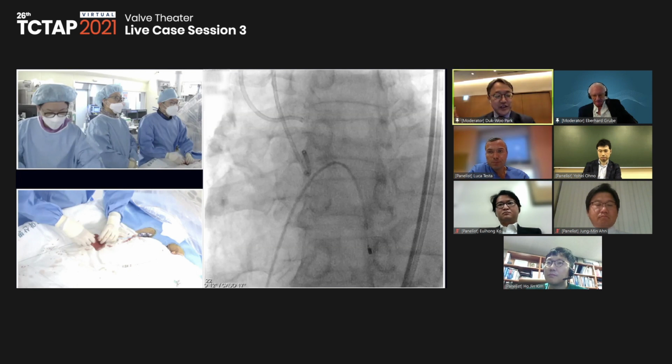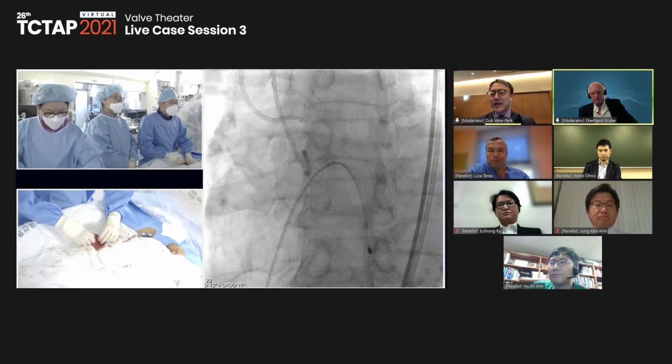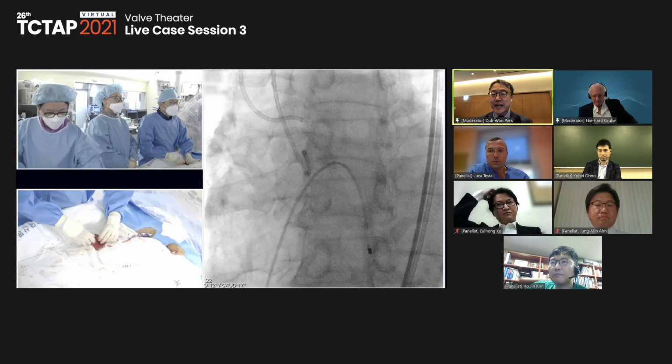And the second question to Eberhard and the other panel: sometimes a patient has creatinine more than 2.0 or 2.5 and is not eligible for CTA in the CT. What is your recommendation? Nowadays we have some painful experience with 3D echocardiography measurement, and we had a root injury a couple of months ago.